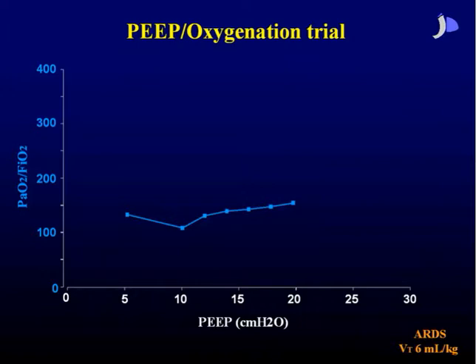And we looked at what happened to the oxygenation. Each level of PEEP was maintained for a few minutes. And you can see that even increasing PEEP to what we can consider high levels, nothing much was happening to oxygenation. There was really no gain.